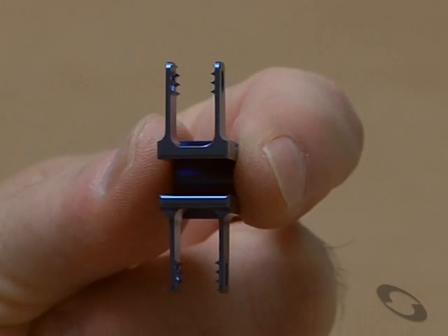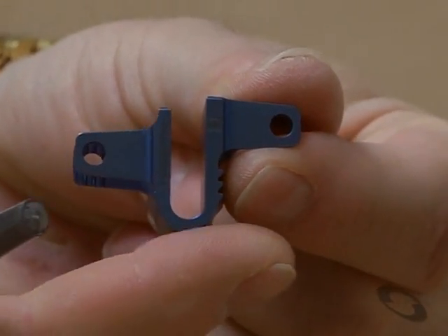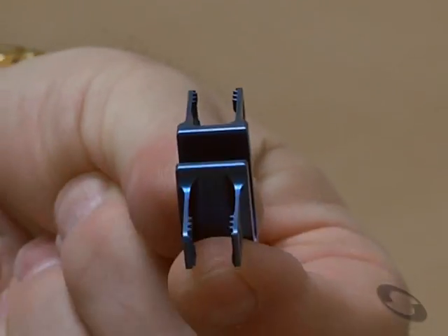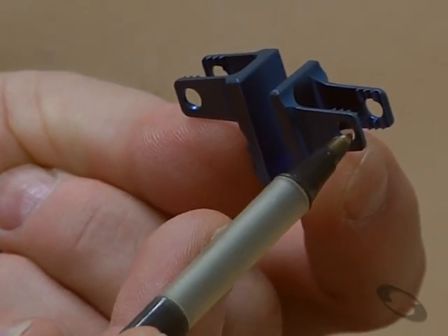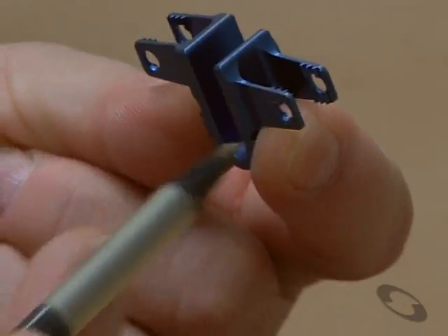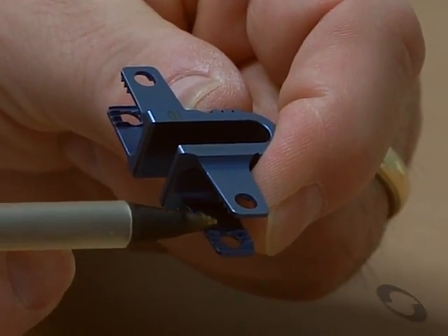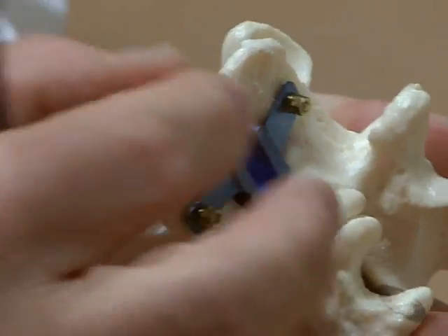This is what the implant looks like. This is the coflex-F. It's a curved implant with the intention of this portion of the curve going down right next to, within 1 millimeter of the nerve canal. And you can see the opening where the rivet or screw goes through. The interior portion of these flanges have a roughened area to prevent them from being dislodged or coming back out this way.